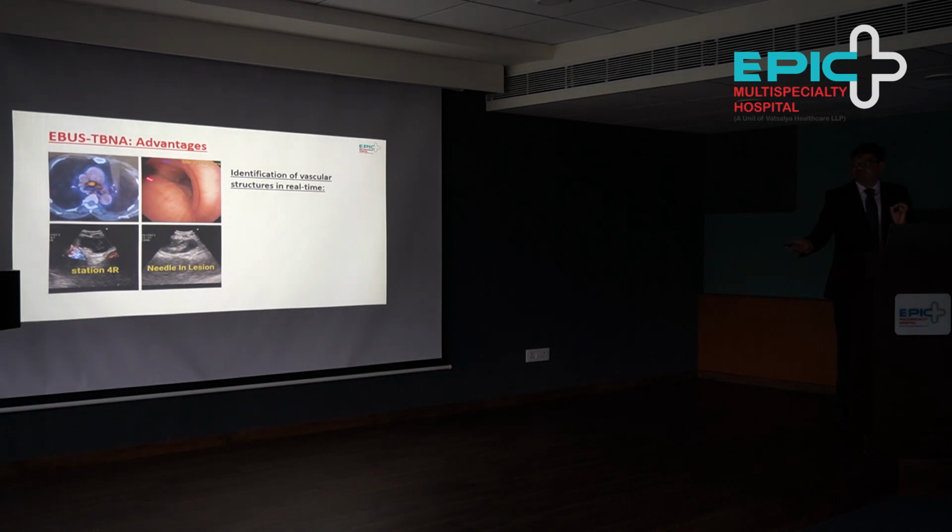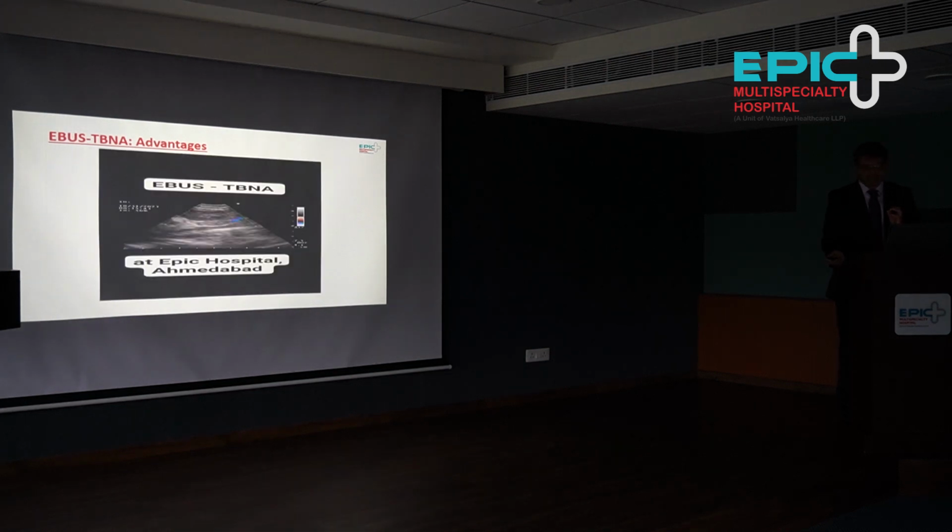We need to puncture. This is the right main bronchus, left main bronchus, and this is the bifurcation called the carina. So we needed to puncture here. We could see here station 4 where there is the SVC line. And then we are puncturing in real time. So this is how we did the sampling. This is a short procedural video.